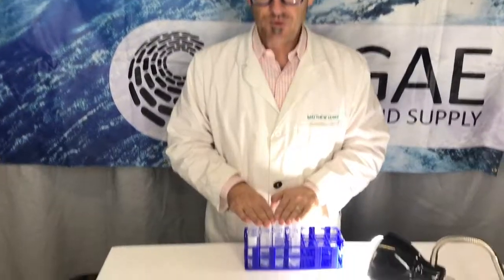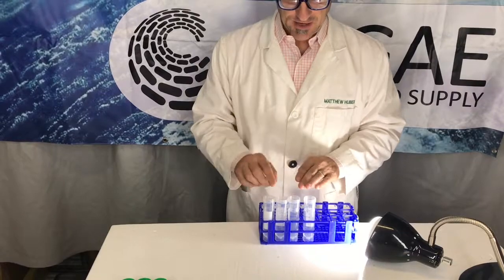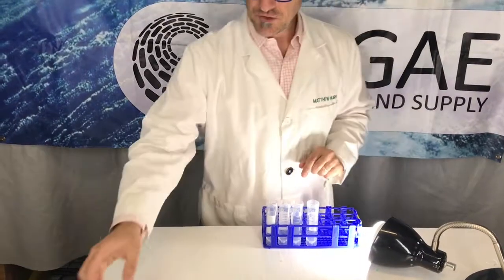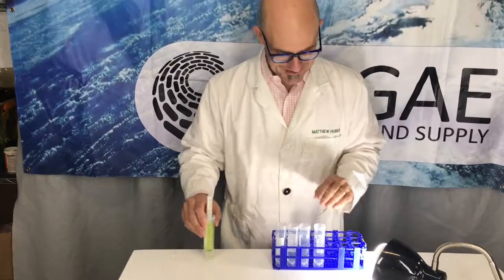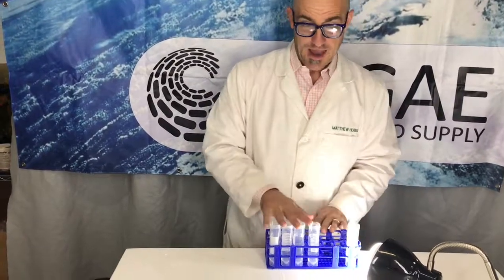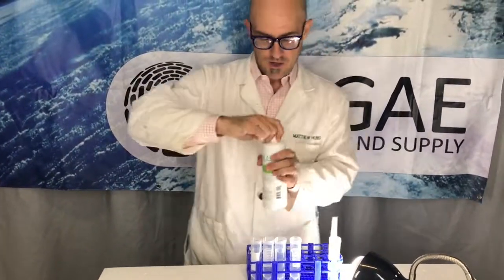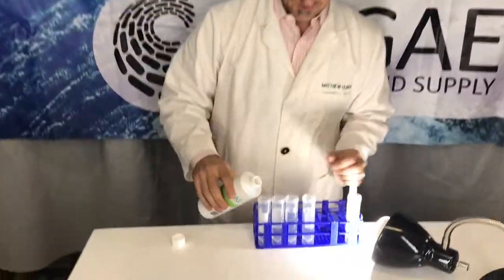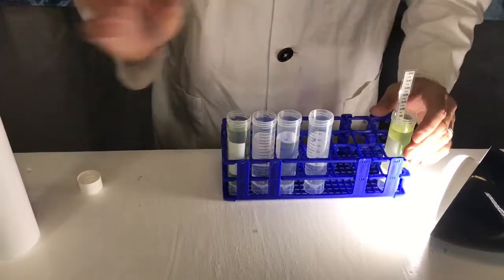What you're going to want to do is use your algae culture media — check out another video to see how to make that — and add it to different centrifuge tubes. Fill them up with the media and then add just enough brand new culture to each one of your flasks, making sure you add the very same amount to each one.